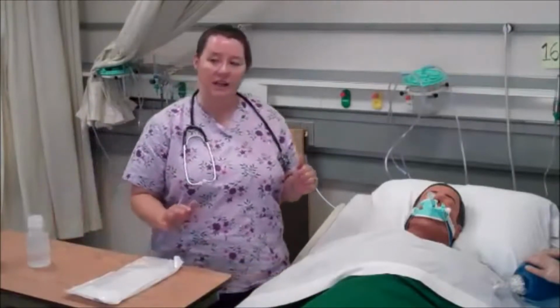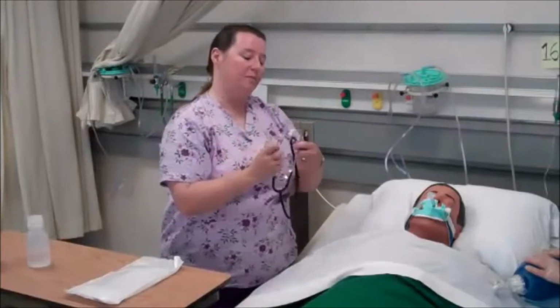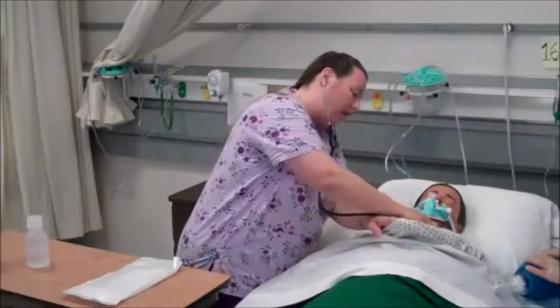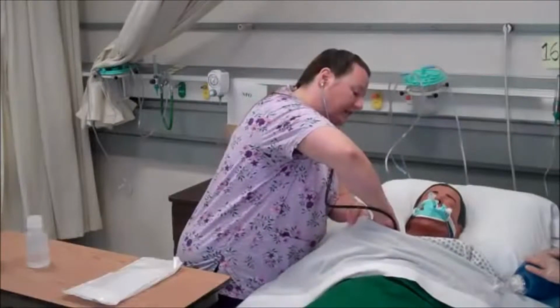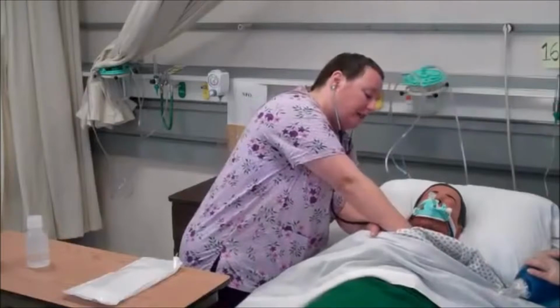So before I do any kind of procedure, I want to make sure I assess my patient. I'm going to use my stethoscope to auscultate for his breath sounds, and I'm always listening skin to scope. I'm hearing adventitious sounds. I could hear rales, I could hear rhonchi, hear coarse breath sounds.